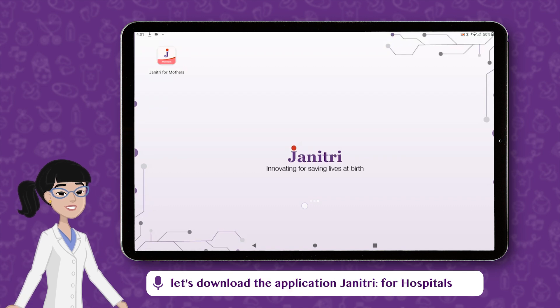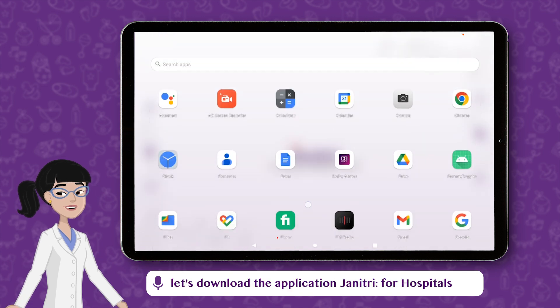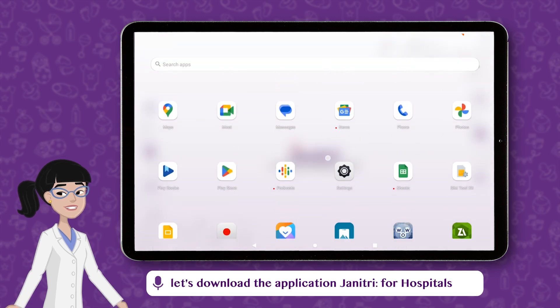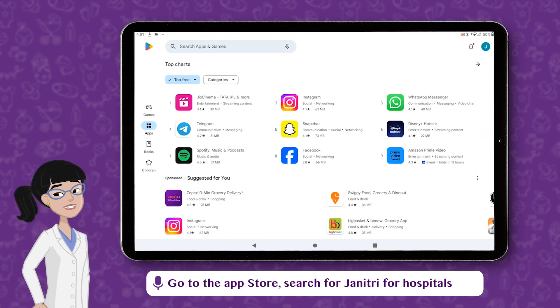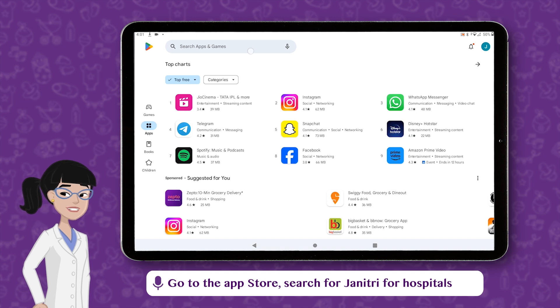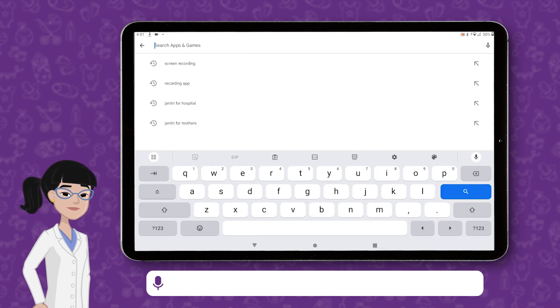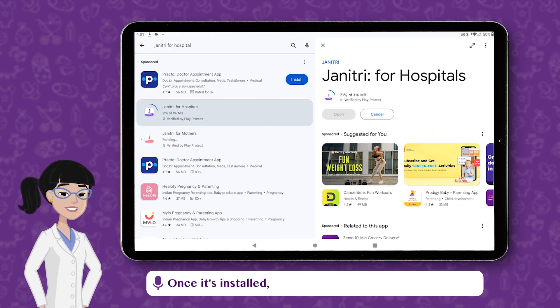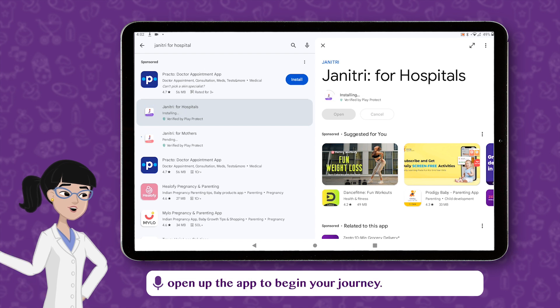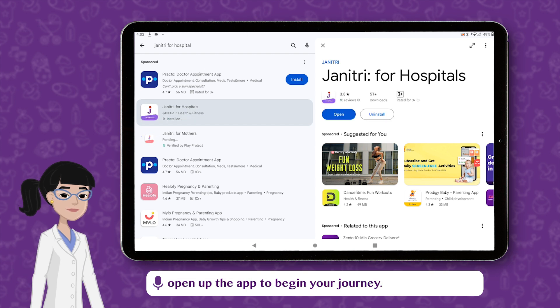First things first, let's download the application Genitri for Hospitals. Go to the App Store, search for Genitri for Hospitals and tap on the Install button. Once it's installed, open the app to begin your journey.